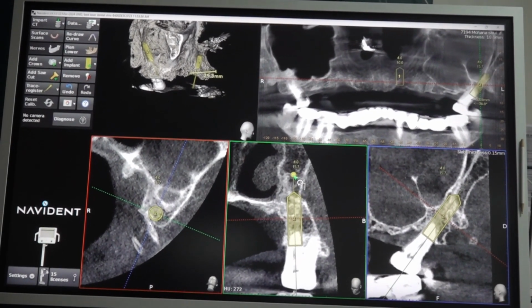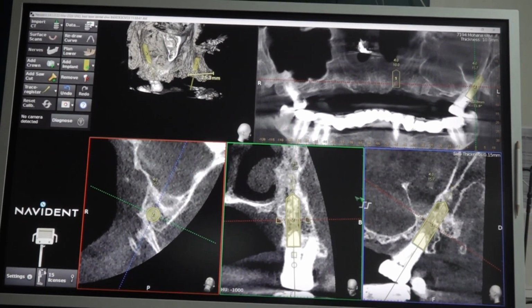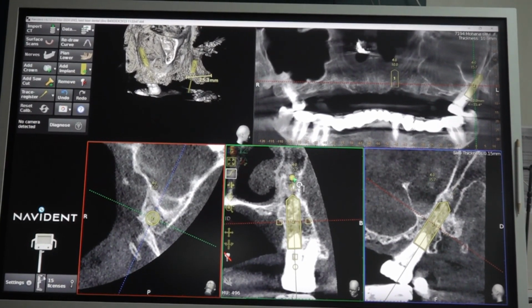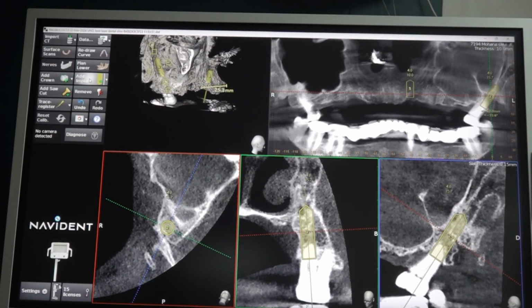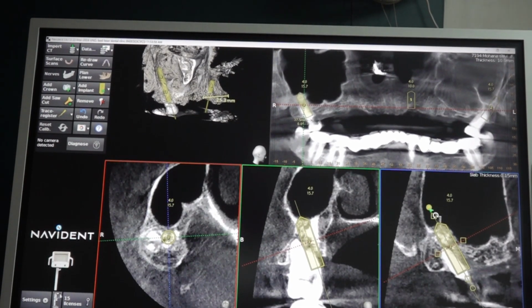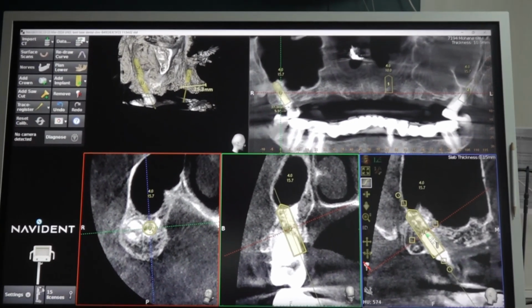Good bone. 4 by 16. Straightforward pterygoid. No difficulty unless you make a gross mistake, because the root angulation naturally points towards the pterygoid area. So the socket itself acts as a guide for us.